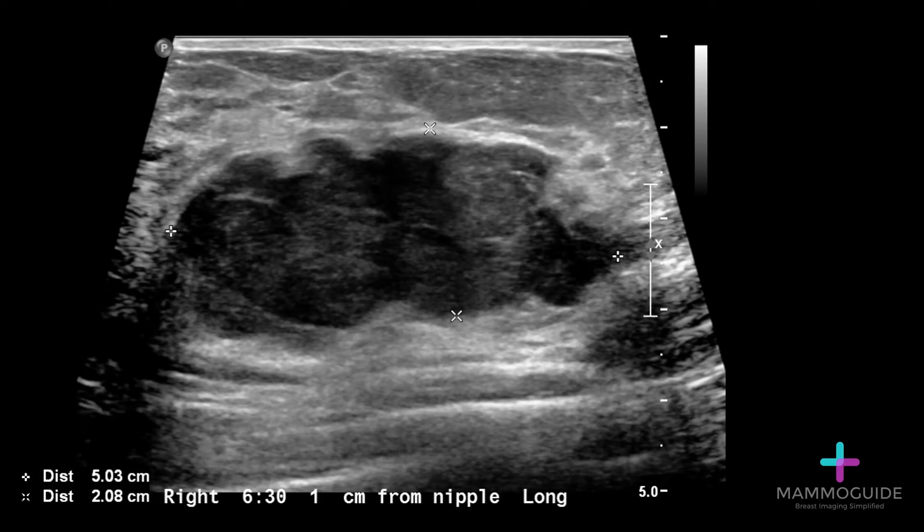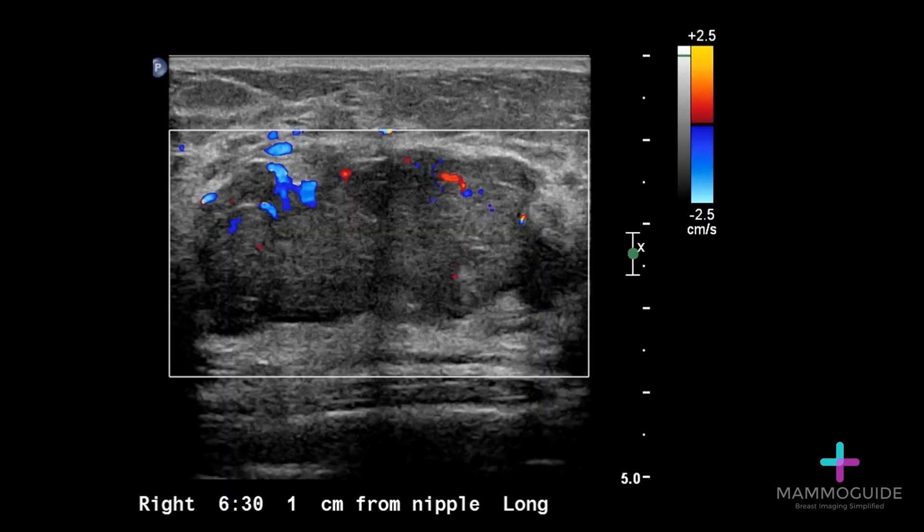This will give you a total of three measurements for the mass. The fifth picture that I would recommend for any solid mass is to perform a Doppler image assessing color flow and vascularity of the lesion.